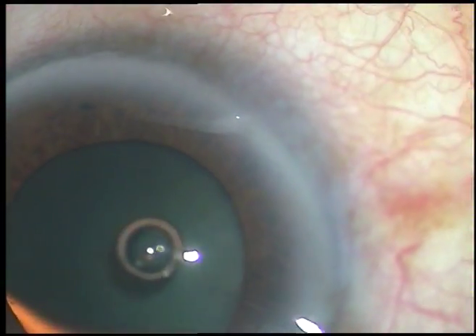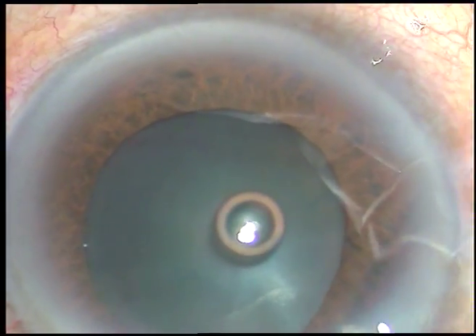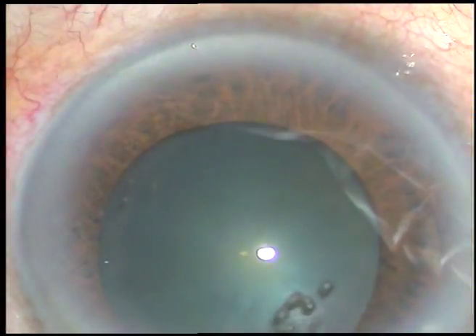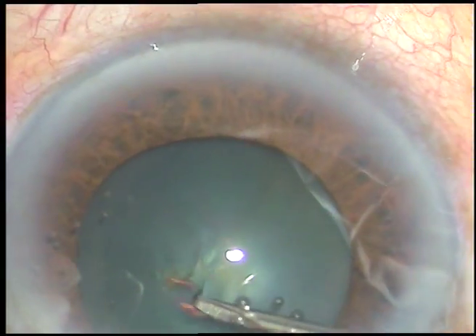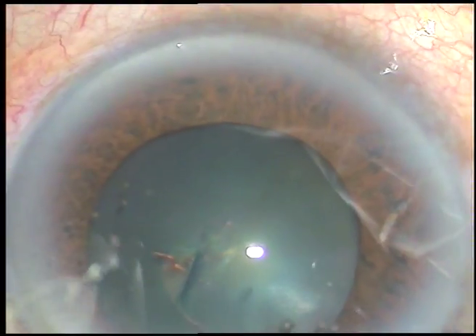If you think that you may need to apply iris hooks, B-hooks, or any kind of pupil expansion device, it is important to stain the capsule first. I have stained the capsule and viscoelastic substance has been injected. Now the pupil has dilated to some more extent after injecting viscoelastic substance.